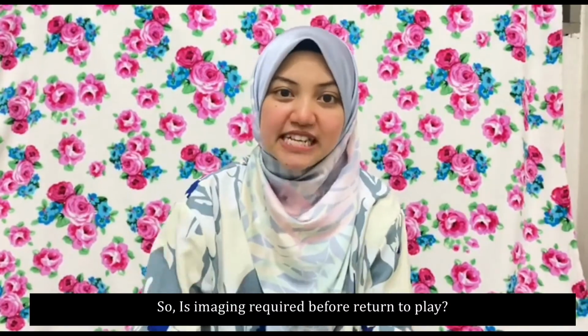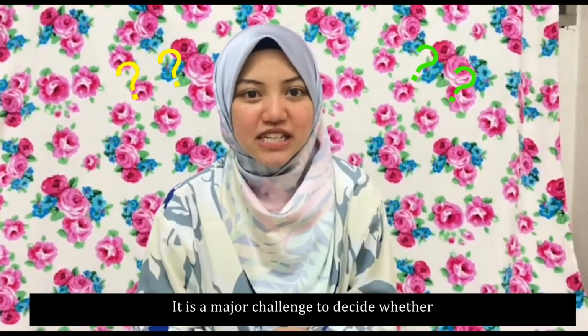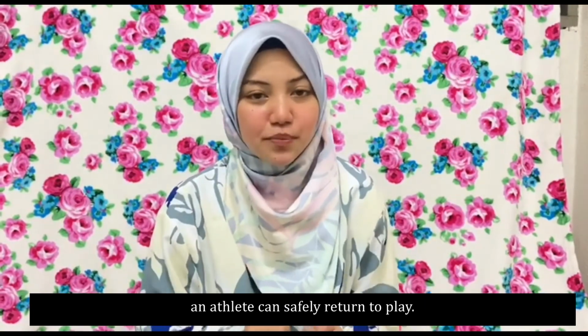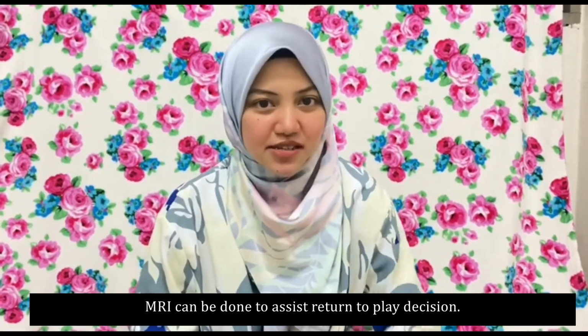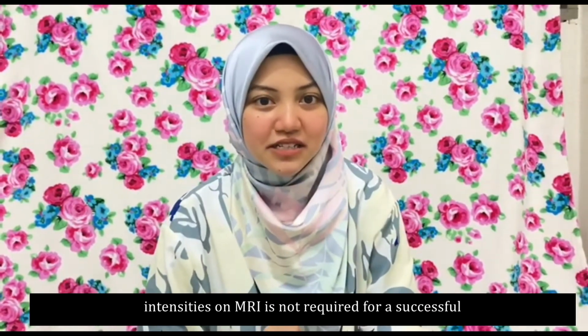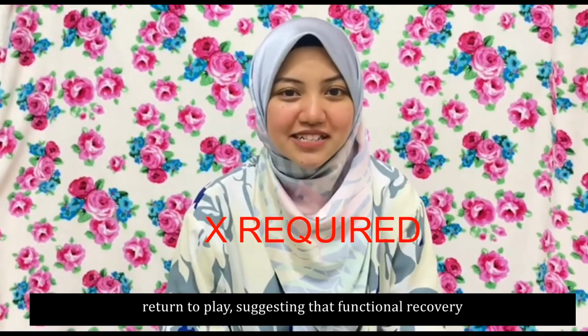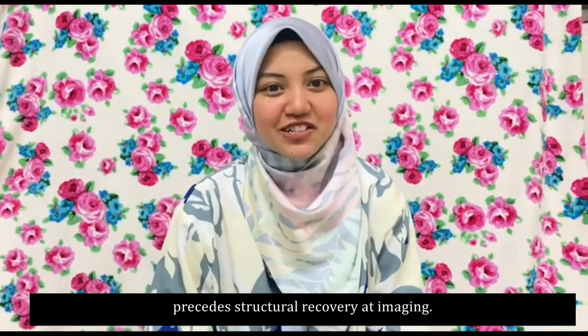So, is imaging required before return to play? It is a major challenge to decide whether an athlete can safely return to play. MRI can be done to assess the return to play decision. However, normalization of increased signal intensities on MRI is not required for a successful return to play, suggesting that functional recovery precedes structural recovery at imaging.